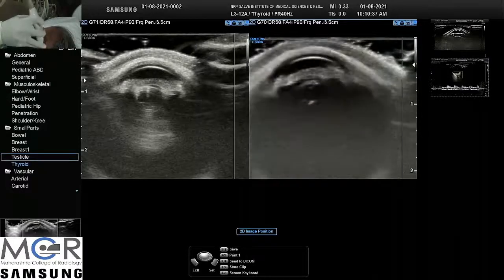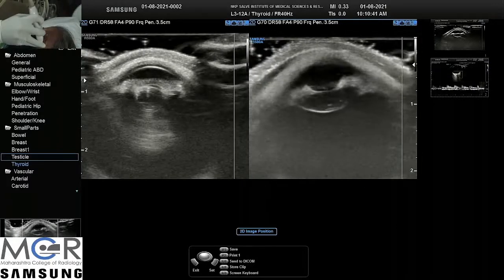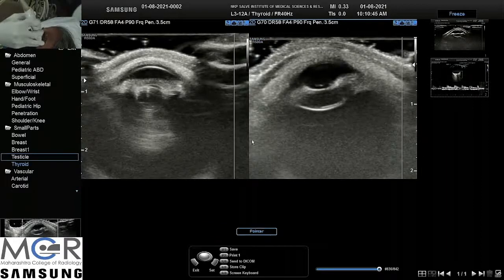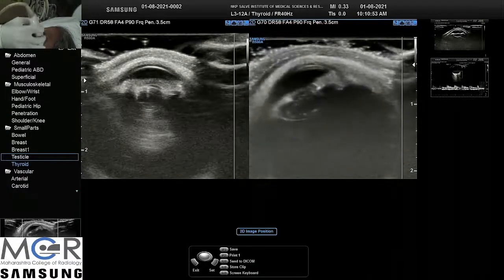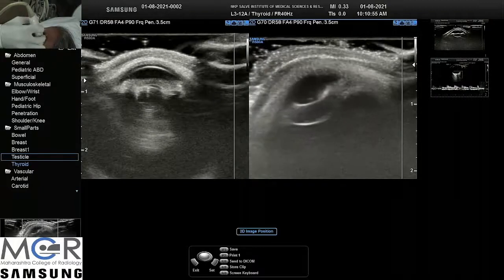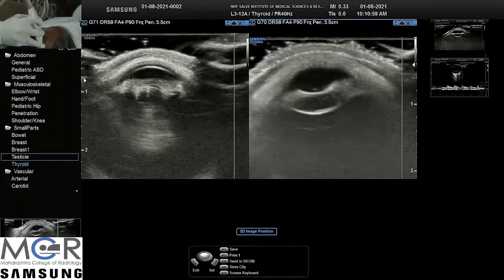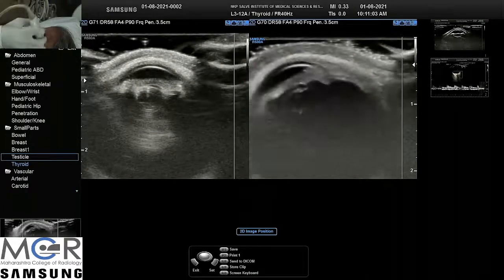There are no internal echoes in the anterior chamber. But what you can see is a little bit of small or thin membrane-like thing seen here in front of the pupil. We'll just confirm whether it is normal or it is a technical issue. Small debris are there in front of the anterior reflection of the lens.